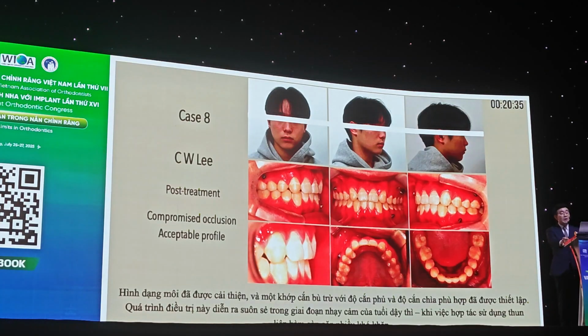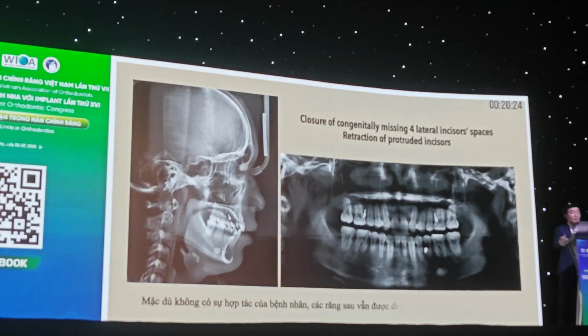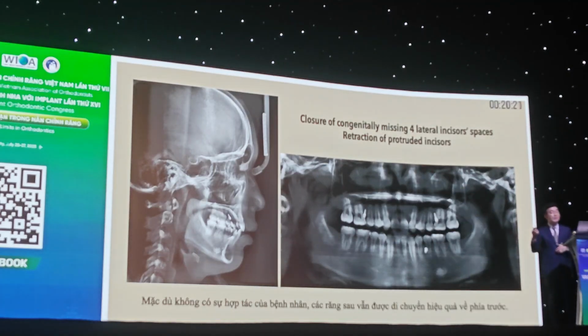This treatment was conducted smoothly in a sensitive adolescent patient when cooperation for intermaxillary elastic use was difficult. Without patient cooperation, the posterior teeth were effectively moved forward.